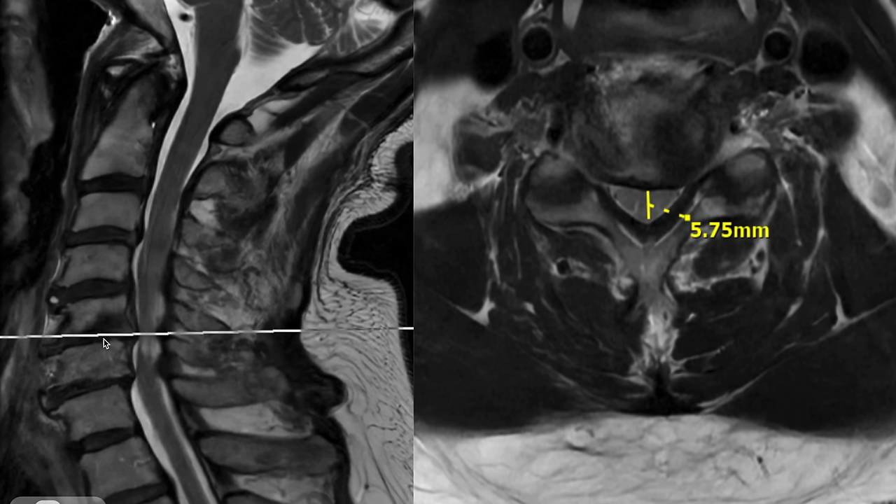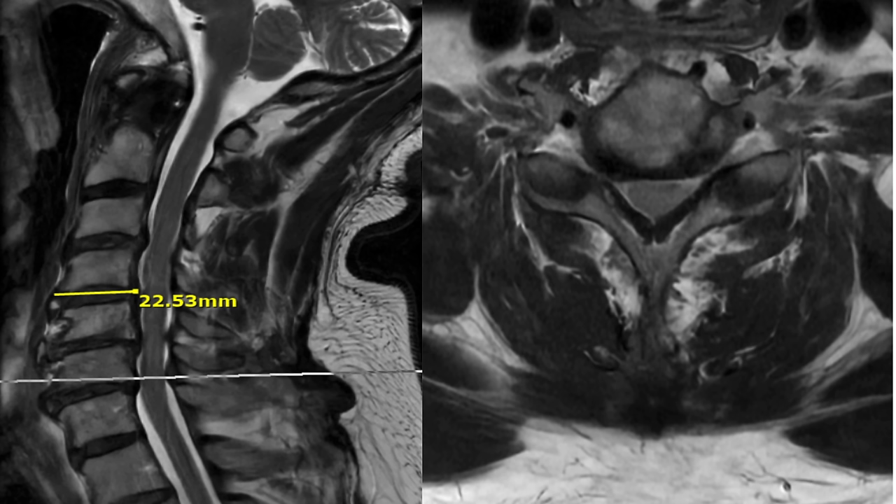You can see this severe collapse at this level — the arthritis and the subsequent compression of the spinal cord and nerves. This patient is having severe neck and arm pain, so the goal of the surgery is to help alleviate some of that. At the bottom level, C6-C7, there is severe compression in the foramen — the nerve on the side of the spine is getting pinched, severely on the contralateral side as well.